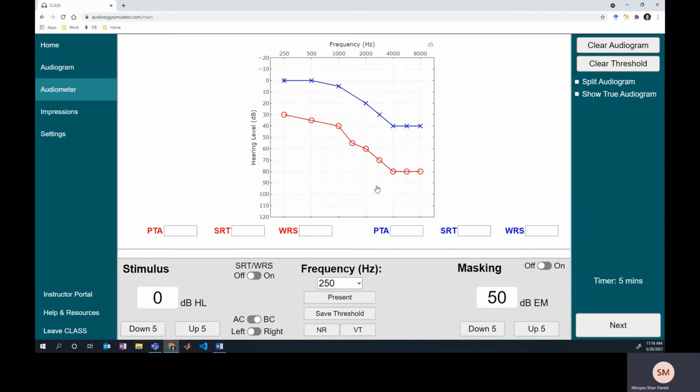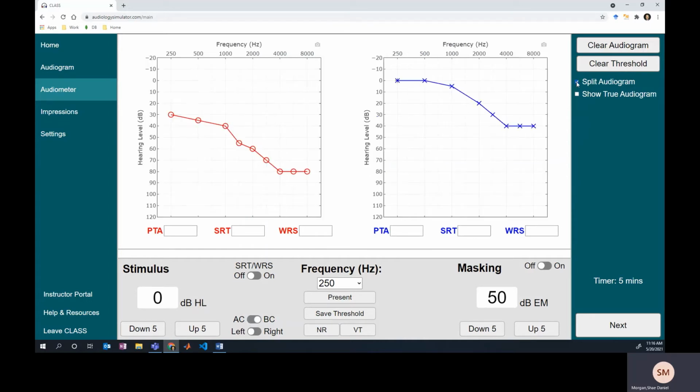So let's go ahead and do bone conduction so that we can figure out exactly which thresholds we need to mask from air conduction. So start in the left ear, that's our better hearing ear. Then we'll save it and switch over to the non-test ear and save it in the non-test ear as well. And there's some debate on whether or not that's ethical to do or not, but if we're assuming a 0 dB interaural attenuation, then that is an appropriate thing to do. But you should always be transparent if you actually tested the threshold versus if you just implied the threshold.